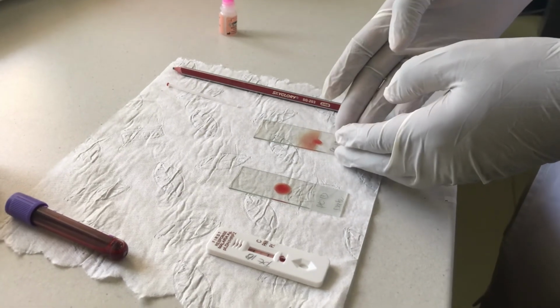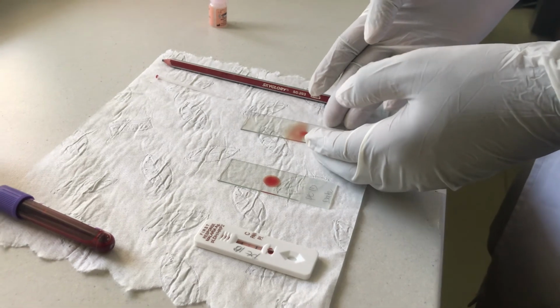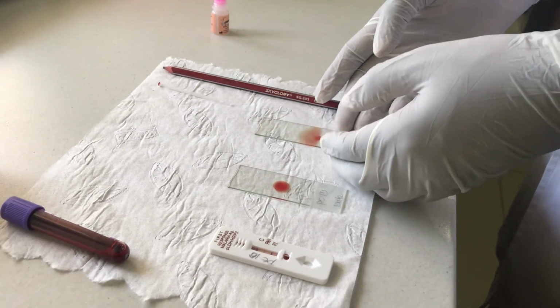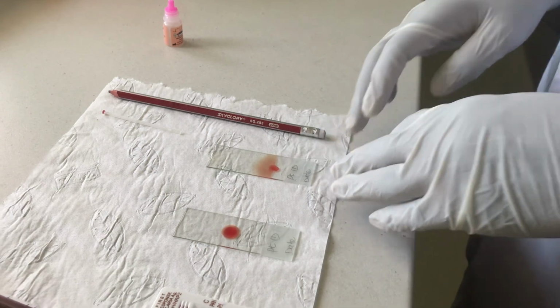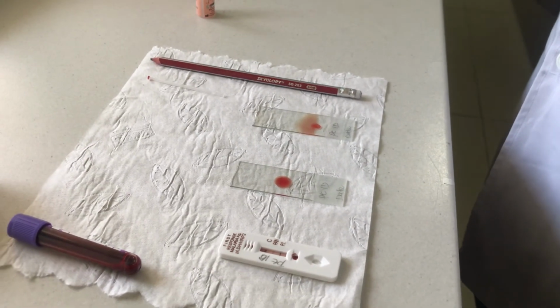So we'll wait for our smears to dry, then you fix the thin smear and stain it with either Leishman stain, or you can use Field's stain, or you can use Giemsa stain. These stains always bring out the best picture of the parasite.